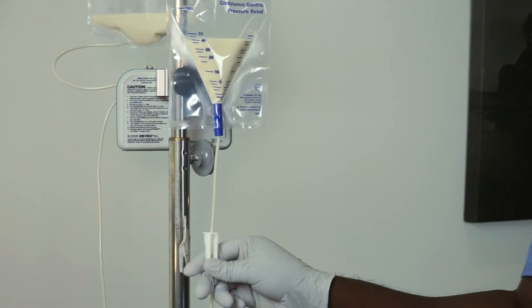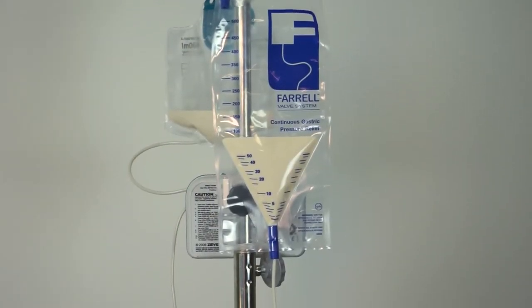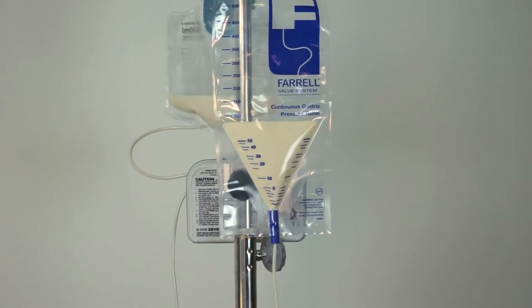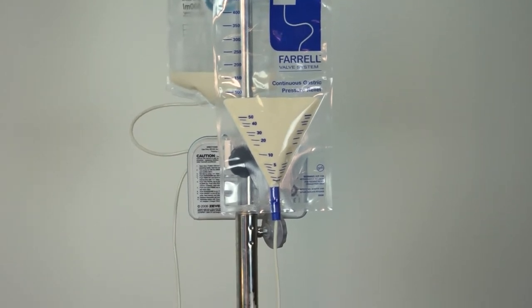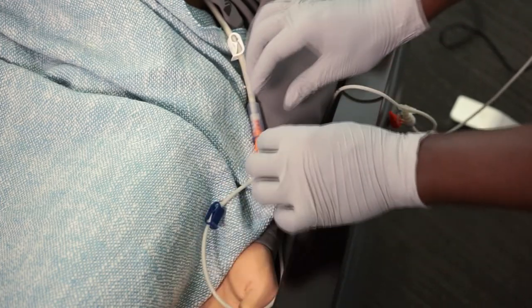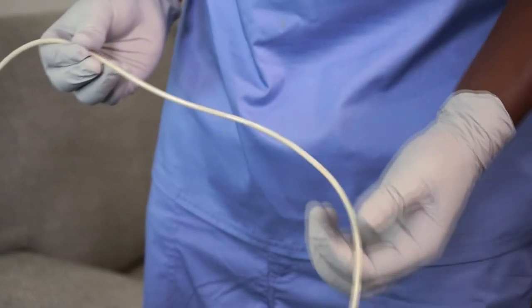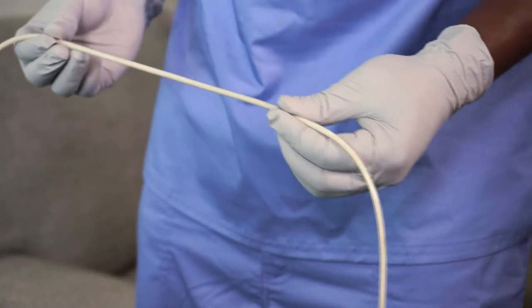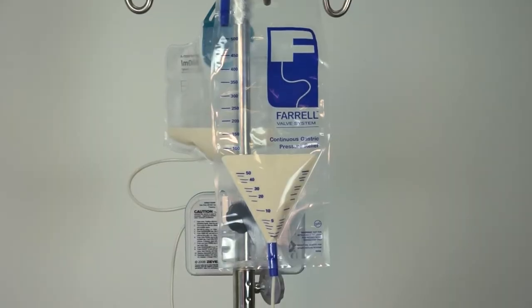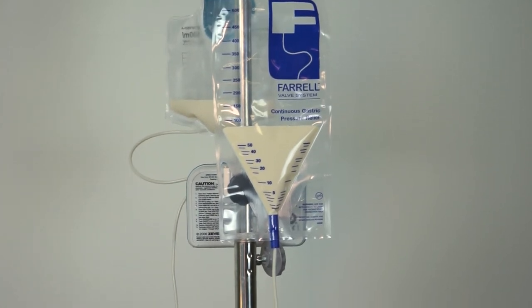If formula begins to back up into the Feral bag, close the white roller clamp located on the line above the Feral Y-port and wait several minutes to determine if the pump can then overcome the occlusion. If this does not resolve the issue and a feeding tube occlusion is suspected, close the blue clamp and disconnect the Feral valve system. Check for occlusions in the feeding tube. Once the occlusion is resolved, reconnect the Feral valve system.